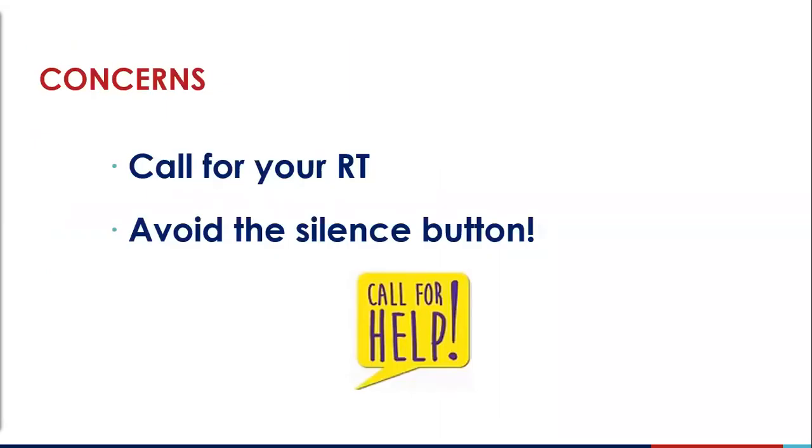Anytime you have concerns with alarms, ventilator changes, or any other problem with your ventilated patient, please call for your respiratory therapist and avoid the silence button.